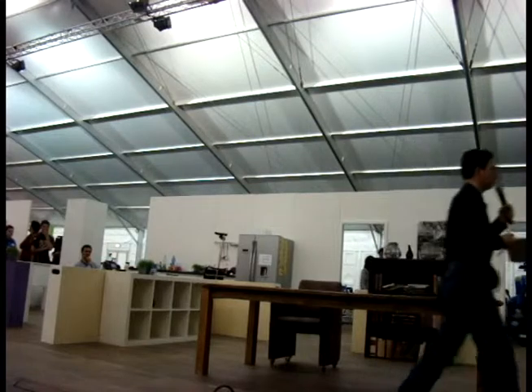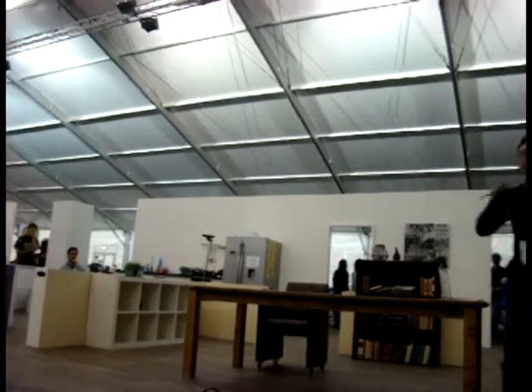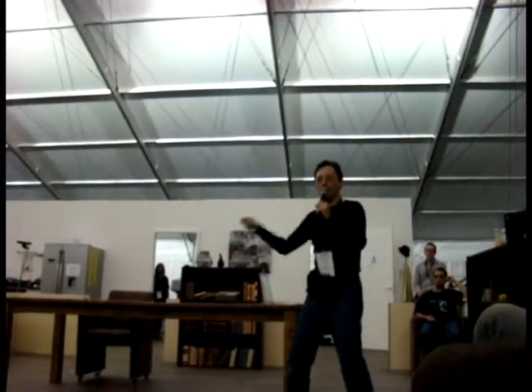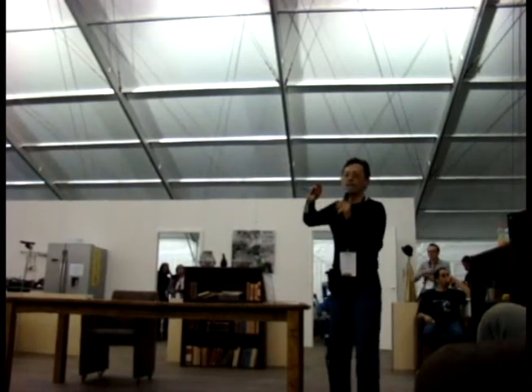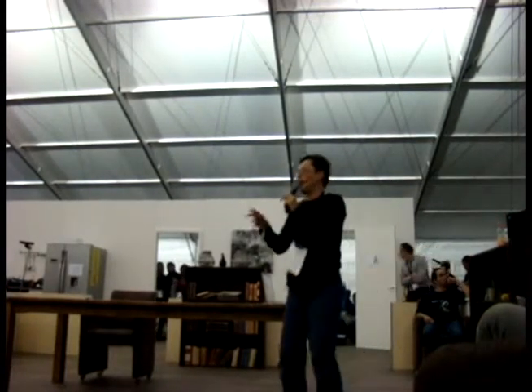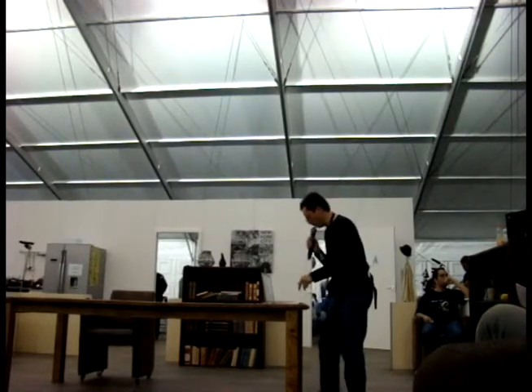So that's my work. It's really tough, believe me. Every day we are like, you know this Jenga game where you have a stack, and then you start taking things out? No, that's exactly my project. Now, well, this wheelchair uses two laser scanners, but I made a trick. Actually, the back one is completely broken. It's not working. So I'm even just using one laser scanner, and all is inside that small computer. I will show you how it works. It's really simple.